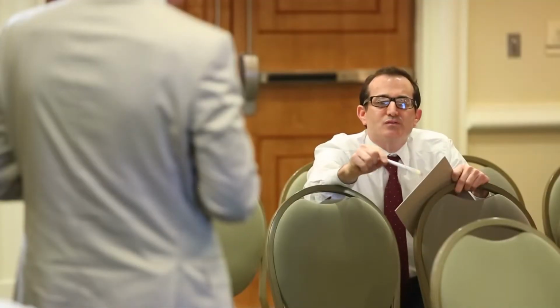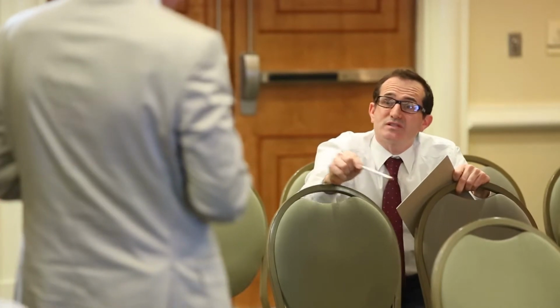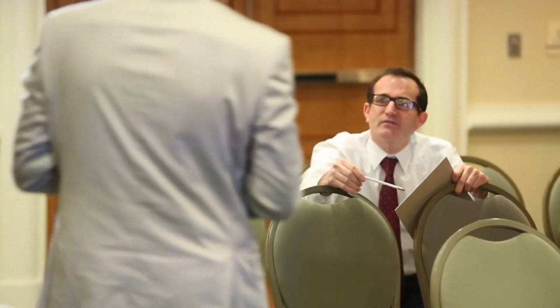So the question I have is, with this mucinous carcinoma that you discovered, was that a pathologic diagnosis from a prostatectomy specimen, or was that a biopsy specimen? That was a biopsy specimen from TRUS. So TRUS detected the tumor and MRI did not. Just by chance, at random biopsy, the patient was lucky that the TRUS biopsy was in the middle of the mucinous carcinoma. So did the urologist send you the patient with this mucinous carcinoma to have the MR? No, it was the trial.